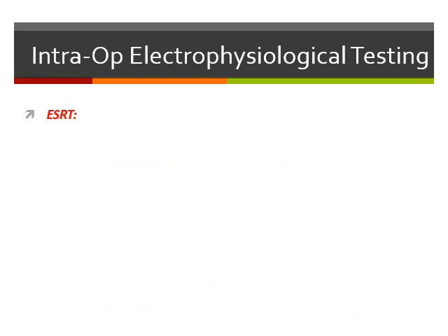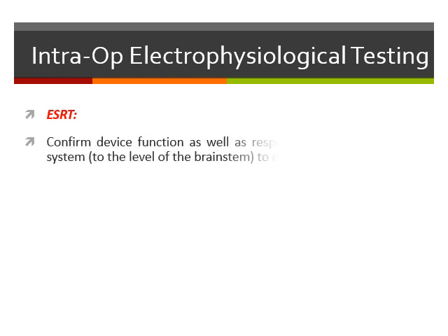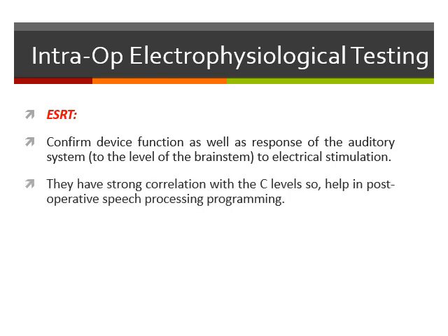Now let's talk about less commonly applied electrophysiological testing. For example, the electrical stapedial reflex testing. Actually, electrical stapedial reflex testing can confirm the device function as well as the response of the whole auditory system, because it includes in its testing the central part.